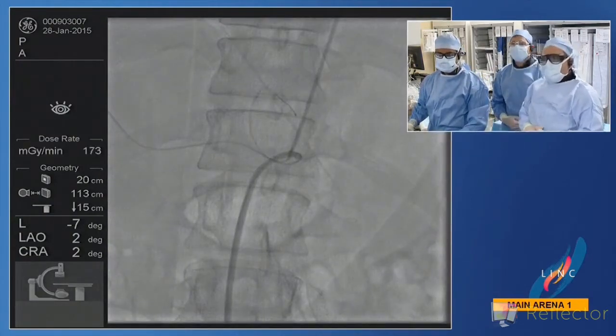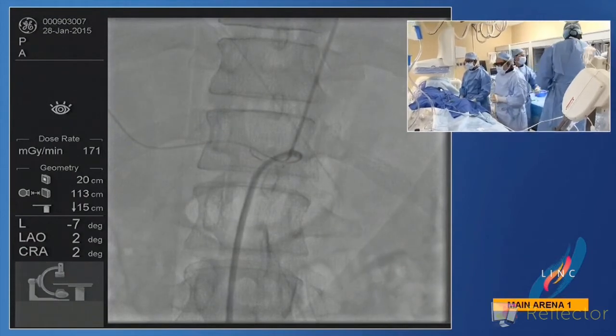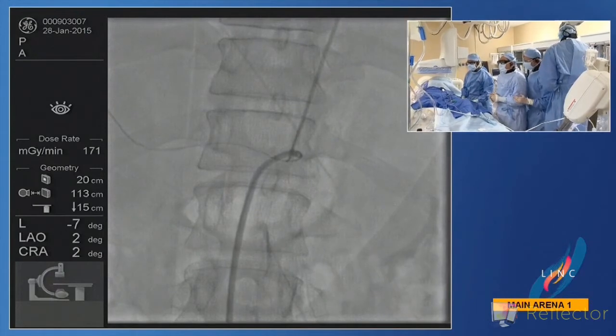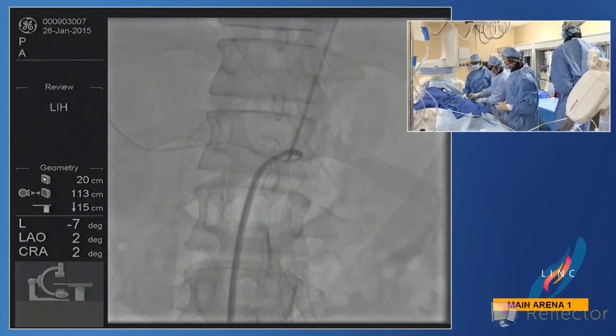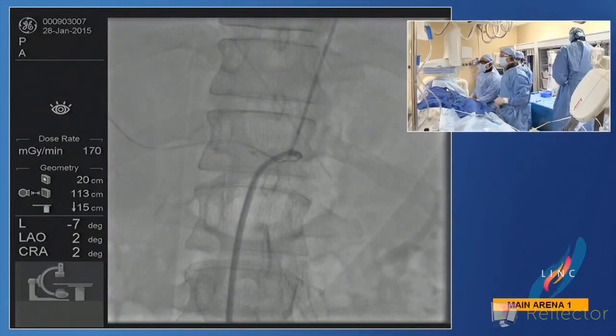Get the artery in the splenic. I think the interesting part of this case, from a non-technical standpoint, I need a 100 centimeter non-taper angle. There's a bunch of things running through my head, but I wonder if John's kind of a closet vascular medicine geek. I hate to tell you all that, but I wonder, John, what you thought was the cause of this.